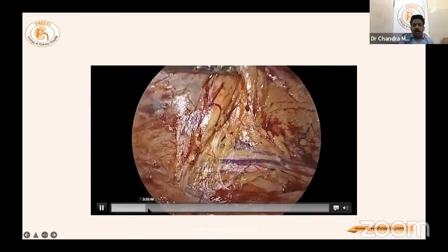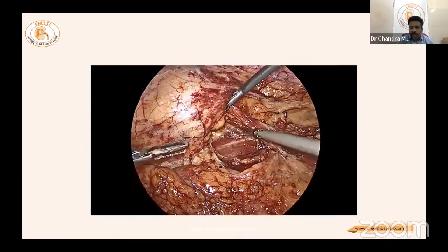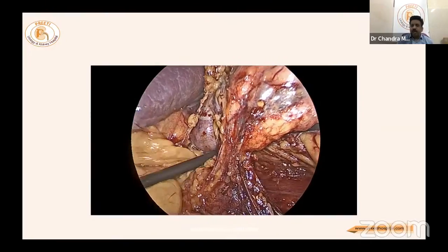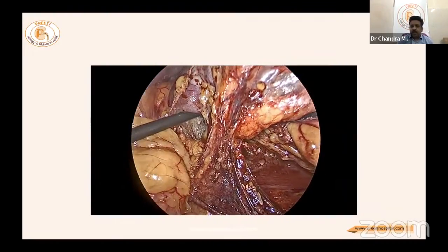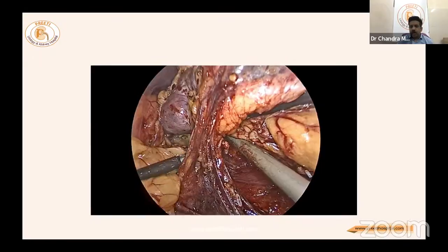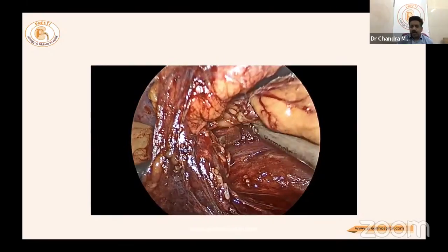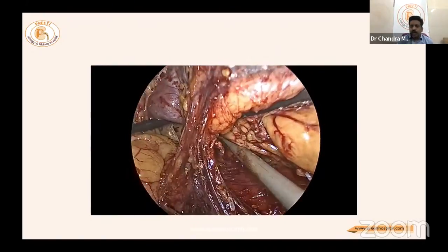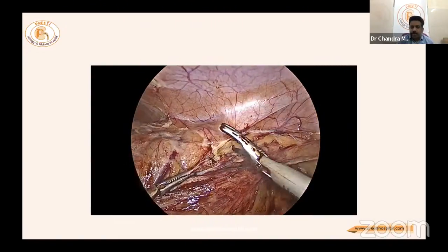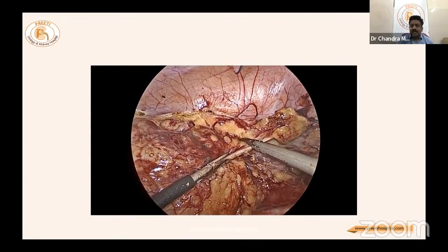Standard lifting of the gonadal and ureteric plexus is done, proceeding to the hilum. Once at the hilum, the kidney is lifted using the fourth port as a retractor. For this benign case in a young female, the suprahilar region is completely separated — all kidney attachments detached, similar to donor nephrectomy — without clamping the renal hilum.